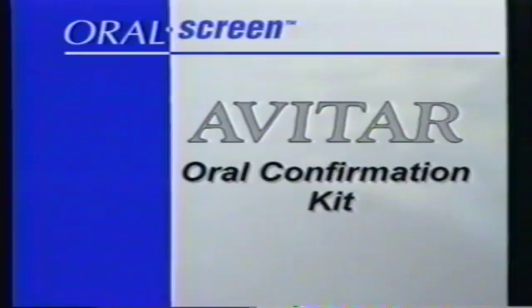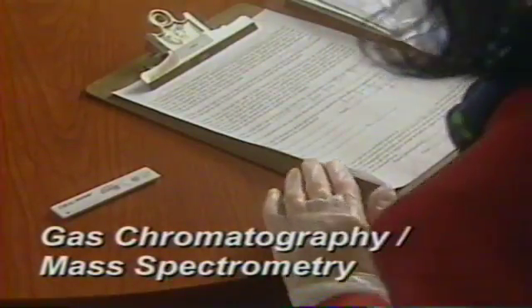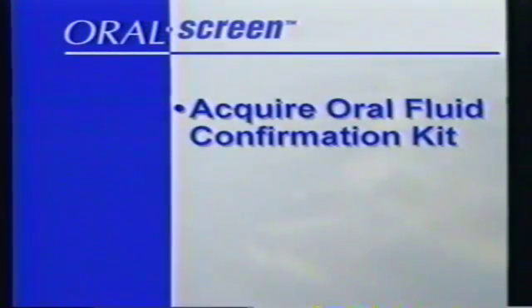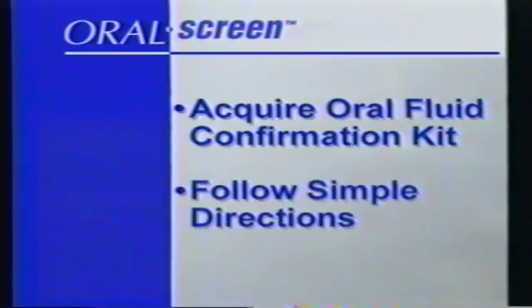Oral screen is a screening test for drugs of abuse. A positive oral screen result indicates the presence of a general class of drugs. It is recommended that a confirmation test be performed on any positive oral screen result to identify the presence and quantity of specific drug compounds and their metabolites. A confirmation test via oral fluid is available from Avitar. The method is a lab-based test using GCMS, a standard test method used in the industry. For confirmation, acquire an oral fluid confirmation kit from your oral screen supplier. Follow the simple directions included in the Oral Confirm Kit.